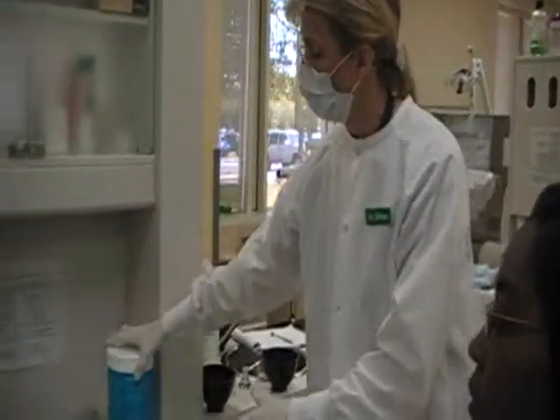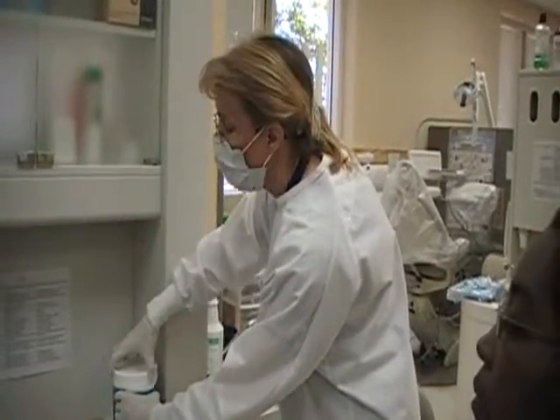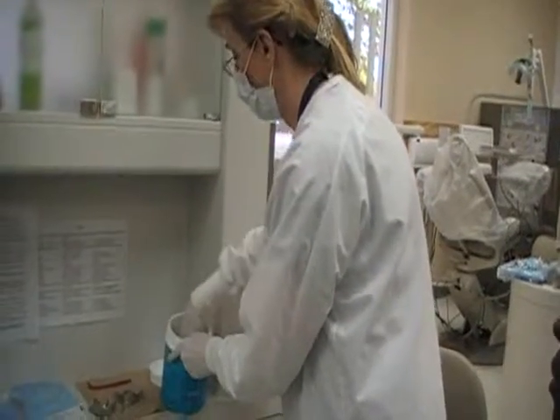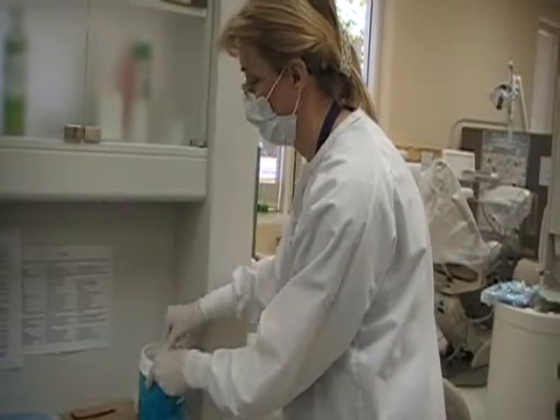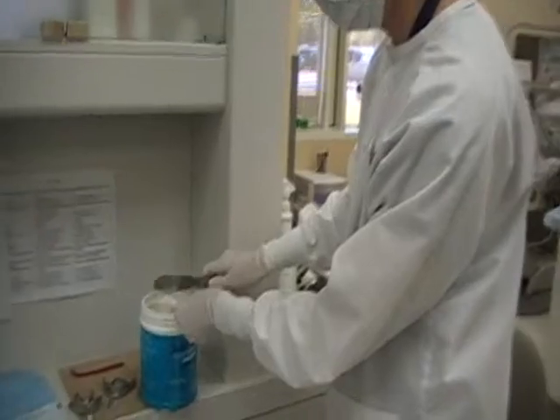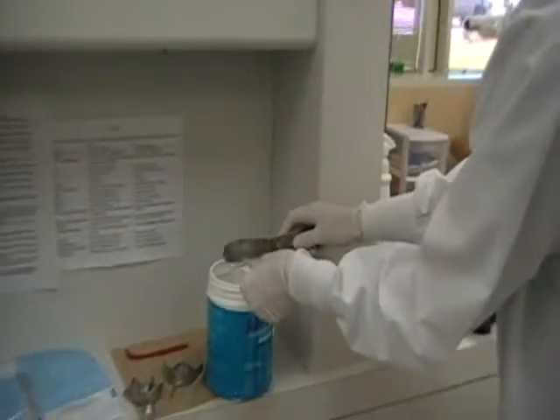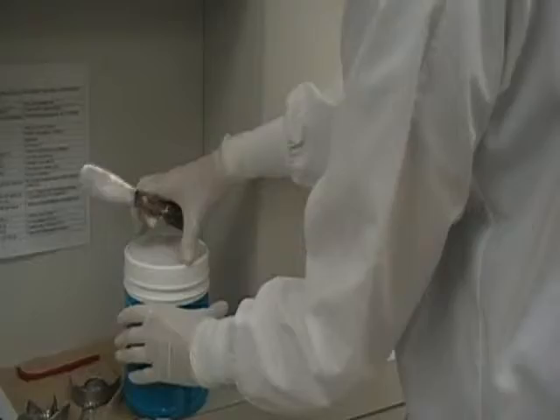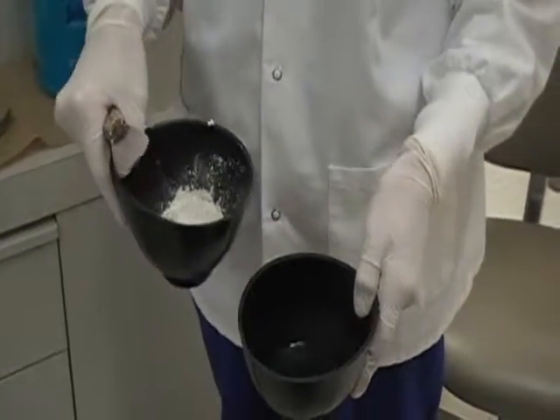We're going to add the water to one bowl. What we want to do is to first fluff the alginate. The reason I'm wearing a mask is because when I open this, there's often alginate dust that can be released and we don't want to breathe that in. Then we find our scooper. What you want to do is tap it very lightly, then slide it, and add it to a dry bowl — there's one measure, and there's two. You always want to add powder into liquid because you want to wet all of the powder particles.